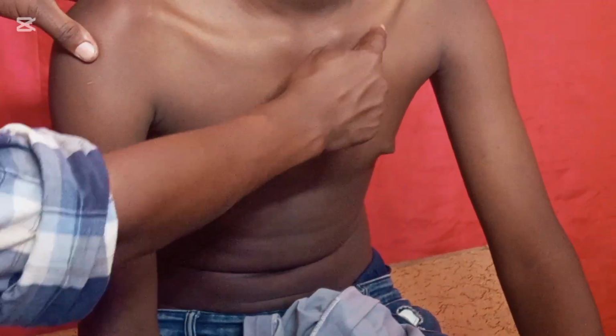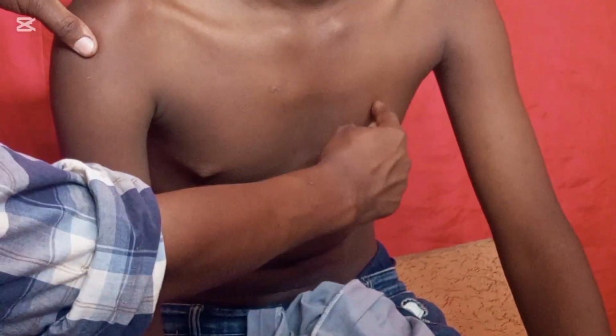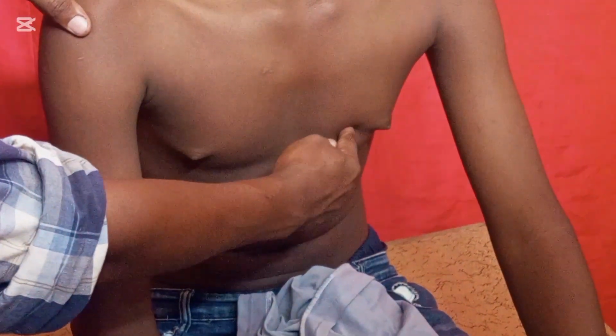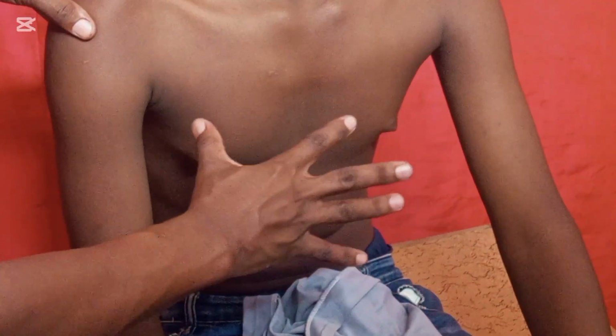Then in between the midline of the clavicle, you move directly down to the mid clavicle. Here is the mitral valve. So these are the areas where we are going to listen to the heart sound.